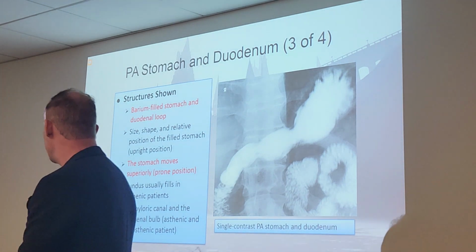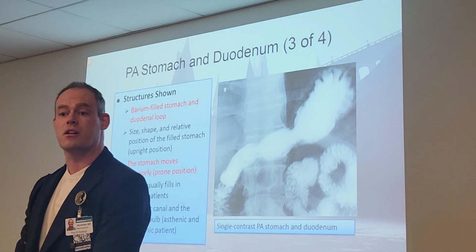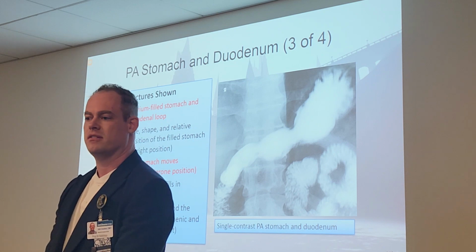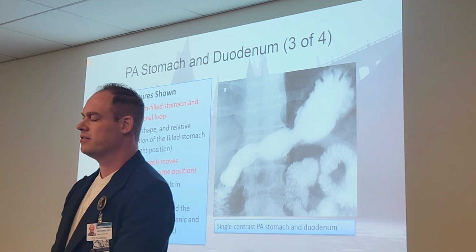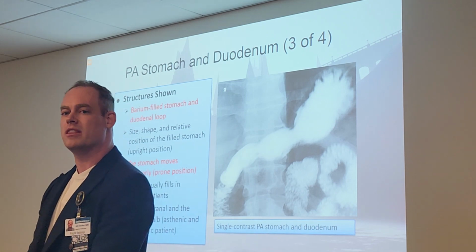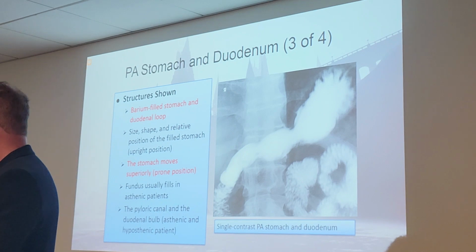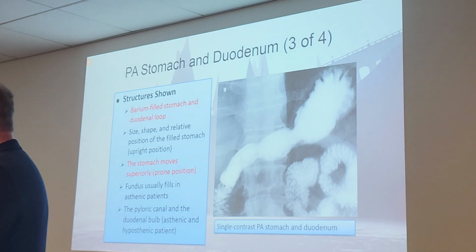And for a PA, this is very important, guys. The stomach is going to move superiorly in the prone position. In other words, it's going to go up higher when we're prone. Also, when we're prone, where does the barium lie? Body and pyloric portions. The air will be where for a PA? In the fundus. If it's not in the body, it's in the fundus. So for a PA, stomach, and duodenum radiograph, the barium will be in the body and the pylorus. The air will be in the fundus.